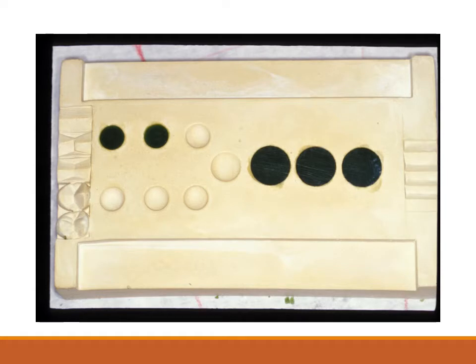We are going to start our journey into waxing with the basic skills of how to use and handle the wax and your instruments. This is the first waxing exercise you will have, which we call the waxing block. This one allows you to practice your wax carving skills using the instruments. The next wax exercise after this one is the drip wax block, which will teach you how to build up the wax into shapes so that you can eventually build a tooth up.